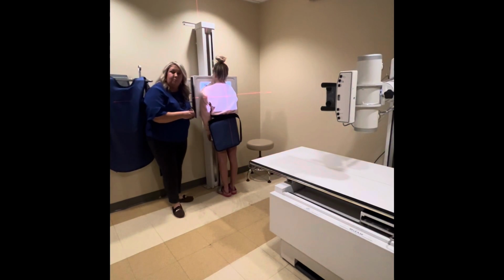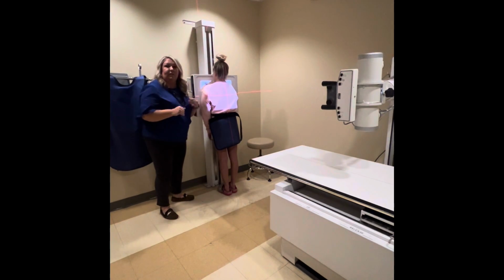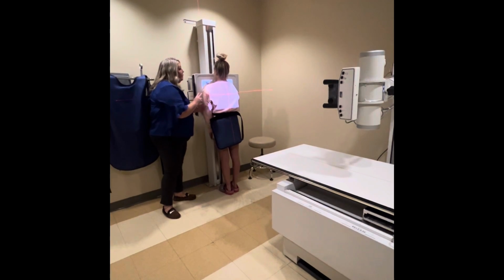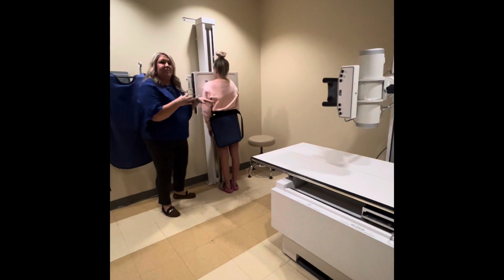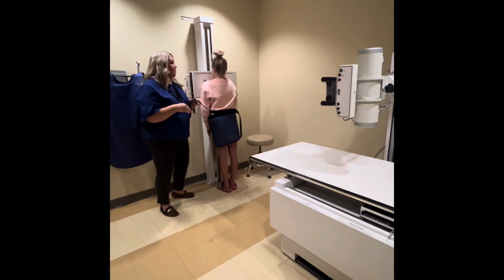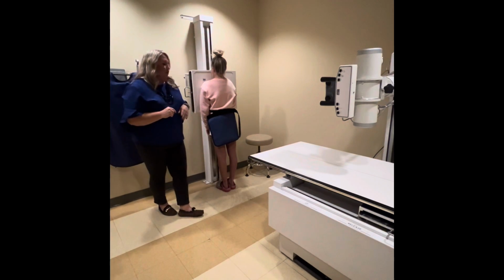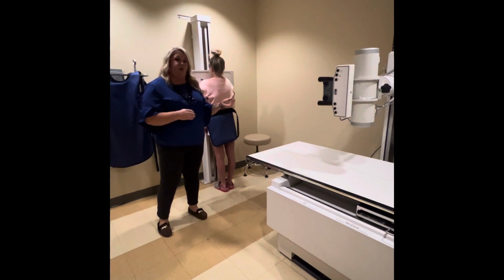Breathing instructions are very important with the chest x-ray, because that's going to give us the different levels of contrast that we need. So what I'm going to have you do is take 2 big breaths in, and on the second big breath, hold it. You always want to tell your patient what to expect so that they're sure of what's going to happen. So you would go back to your control panel. You would tell the patient, take a big breath in, blow it all the way out.